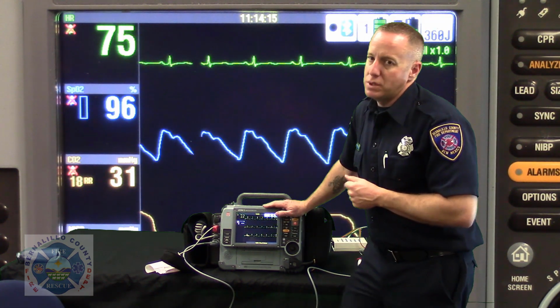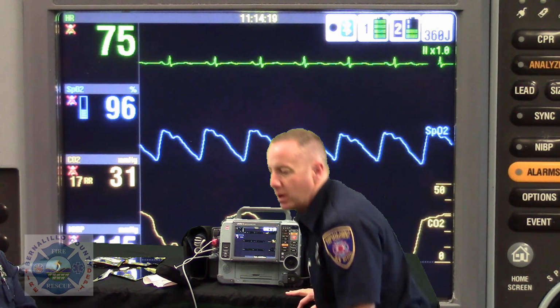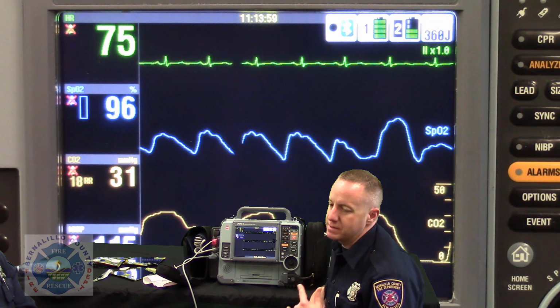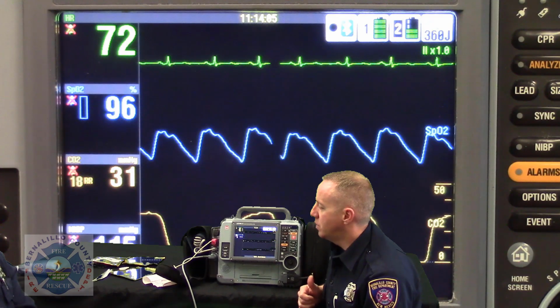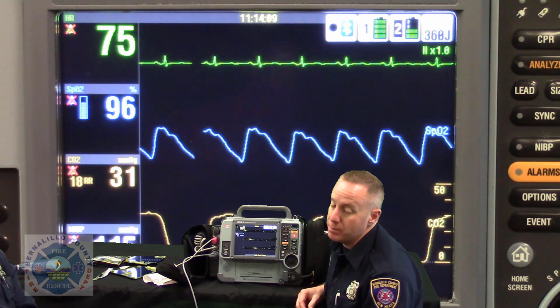So it's important stuff. So we've made patient contact and we've prepared the patient for a 12-lead acquisition. Again, our person who's wiring the patient up has taken the time to explain to the patient what our goals are, and that is to minimize patient movement, to use electrodes out of the manufacturer's packaging and nothing out of a Ziploc bag.